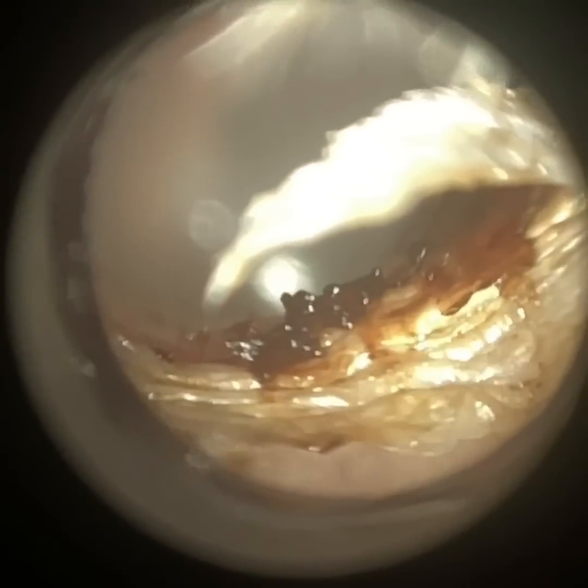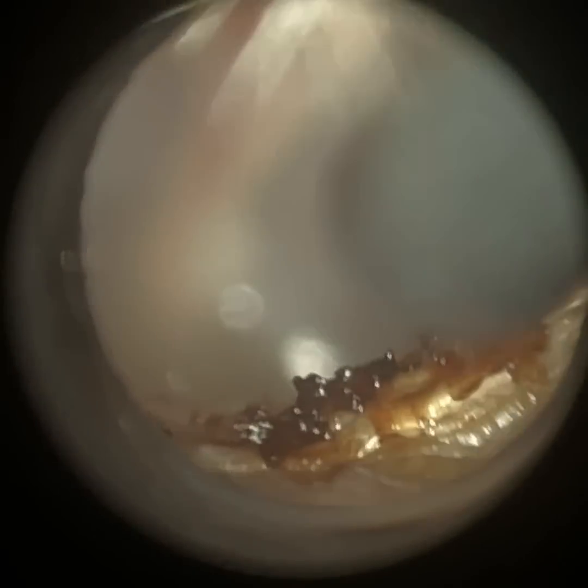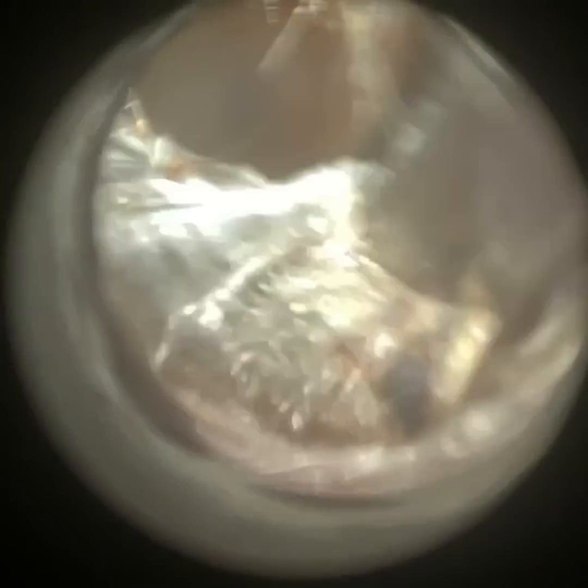And this patient's ear canal, I wouldn't say it's... most people's ear canals are oval shapes. And what I mean by that, it takes on the shape of an American football, or in the UK, a rugby ball, like an egg, an oval. So the height is greater than the width. I would say in this patient, the height and the width were actually very similar. There wasn't much difference, which gave it a very circular anatomy. And obviously when you're used to seeing the normal oval shaped ear, just take a moment to adapt for that actually in the procedure.